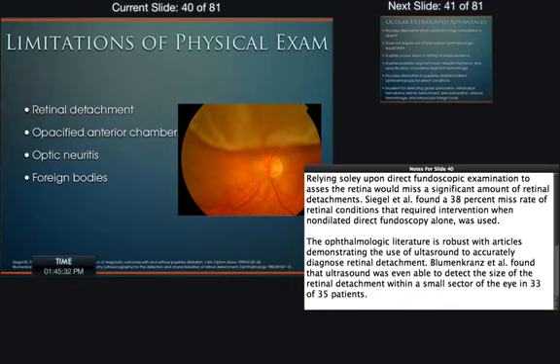Now, this is a beautiful image that you see in textbooks. Very hard for me, struggling with this awesome device, the ophthalmoscope. I really struggle trying to get this image, okay? This to me is a very challenging thing. I wish I was better at it. I try, but it's hard, especially in an eye that's got a constricted pupil. I haven't given up on it though. I'm still trying, and someday hopefully I'll get better at it.